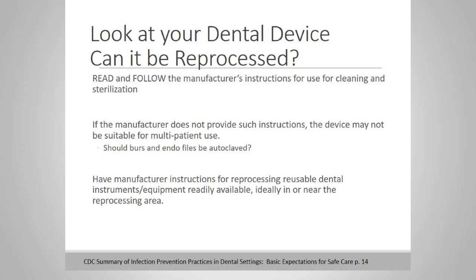Some instruments that fall into this category are burrs and possibly endo files. Some are considered single-use, some are considered multi-use. Some countries mandate that these are single-use only. So check with your manufacturer's instructions and know the regulatory guidelines in your area where you are practicing.